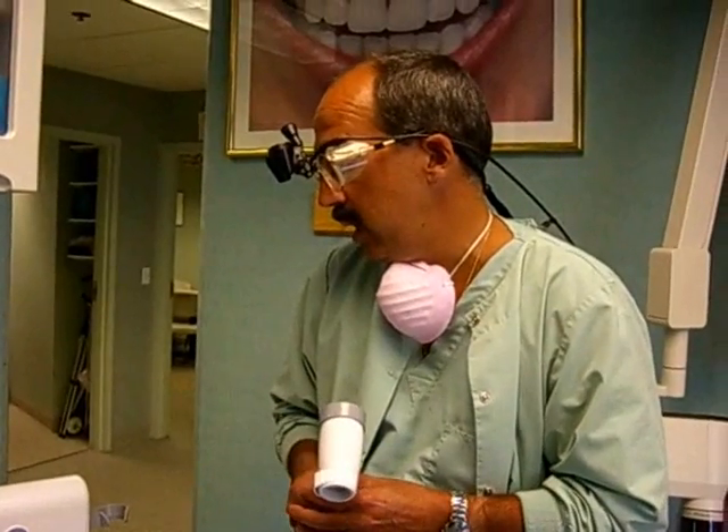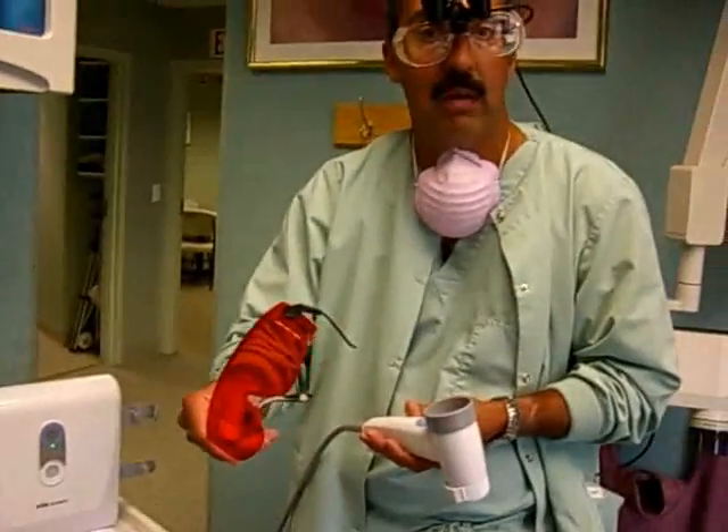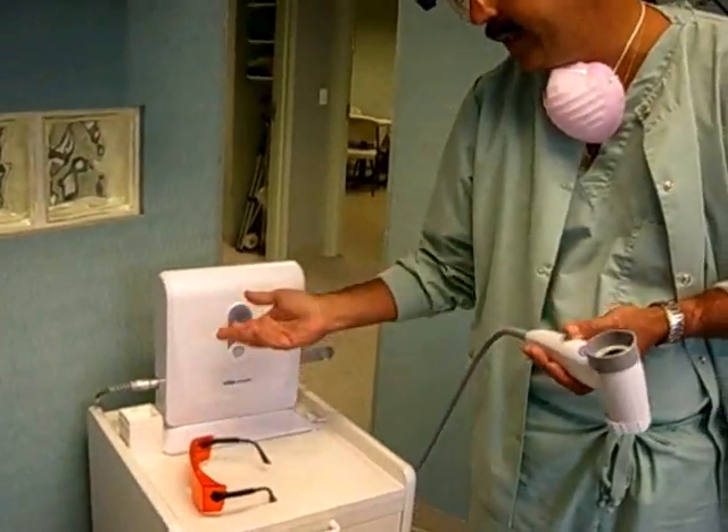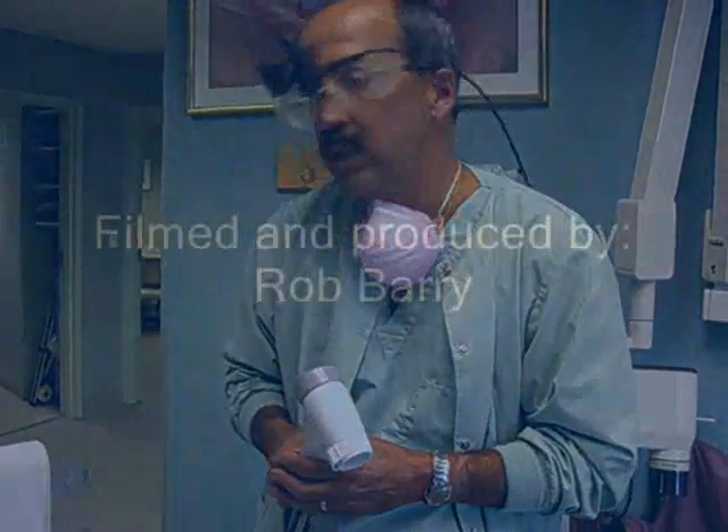That's basically it. It's a very simple process, very painless. The patient just wears safety glasses while we do the exam, and it generally takes two to three minutes to scan the inside of the mouth and give them a clean bill of health. Something we now recommend about once a year.